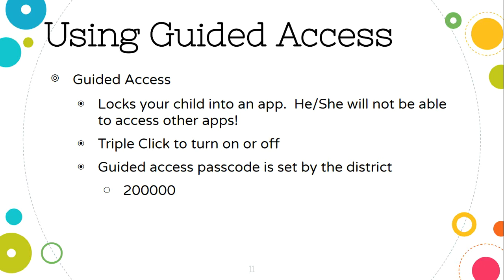The other thing we want to just be able to do is communicate to your child that this iPad or this device is only for your voice, so they don't think that they can hit that home button and go out and find another app. Most of your children, all of our students in kindergarten and first grade have one-to-one iPads, so they would have two.